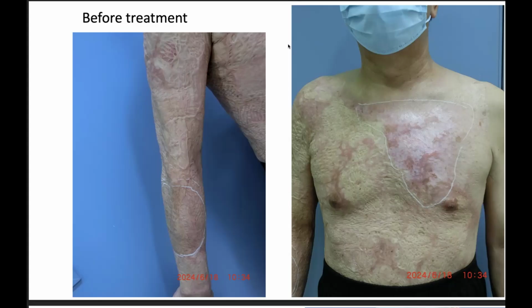So after I discussed with him, I tried to use Erbium YAG fractional laser, and the primary focus is his anterior chest. At the same time, I also treated the right forearm as a control target therapy. Next slide.